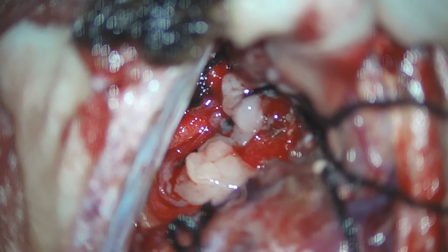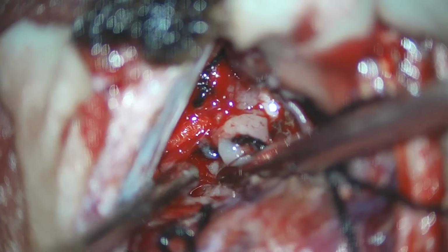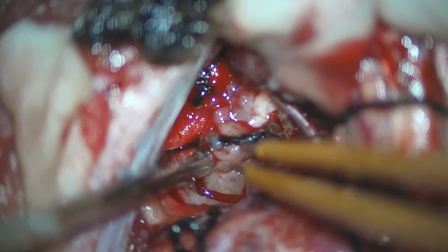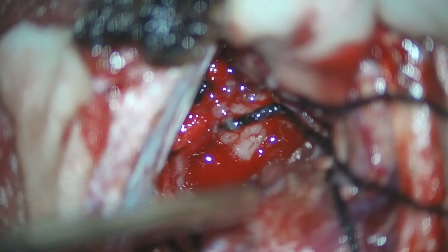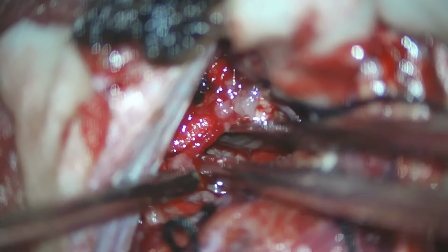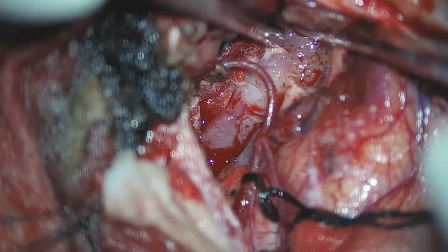Again, the tumor is now being debulked with the debrider, and we can see the tumor is being easily sucked into the debrider, and again we have to look for adequate hemostasis in this step also. Now we can clearly see the anterior cerebral arteries, which were earlier pushed. Now they have fallen into the normal place.